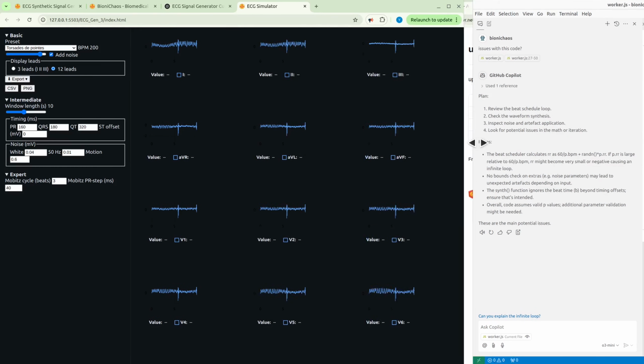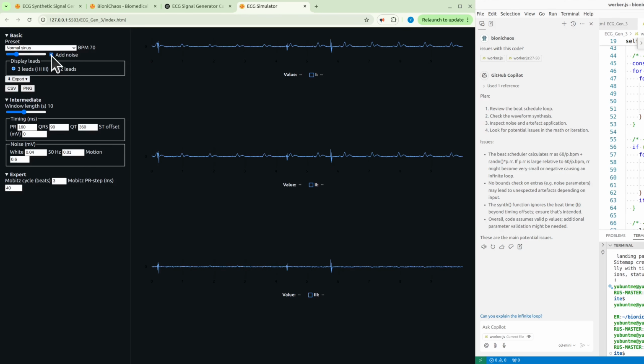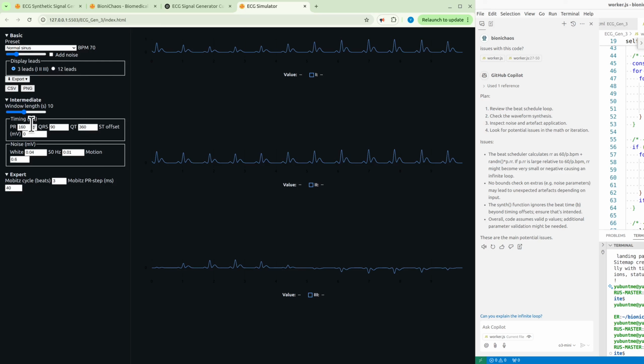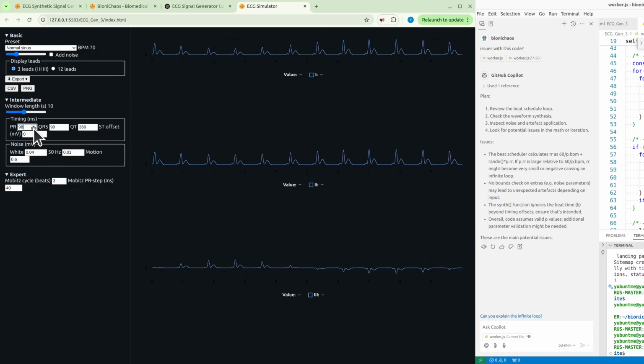So we actually have to see how accurate this is. It doesn't look great. The noise is distorting it too much. If you remove noise and change the PR timing, it's actually working okay. It's that blip there that is moving away from the peak. 320 is the max, and now it should be coming closer to the peak. Yeah, it does. So that's really nice. What's the minimum for it? 80. Yeah, 80 is when it's almost overlapping onto the QRS. So that's really nice. Thank you very much.